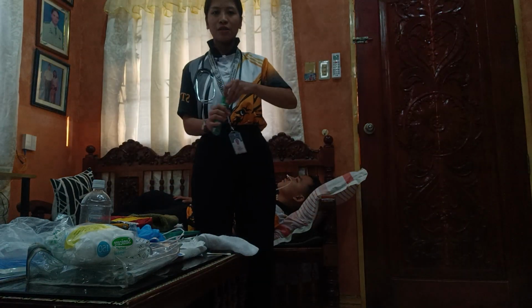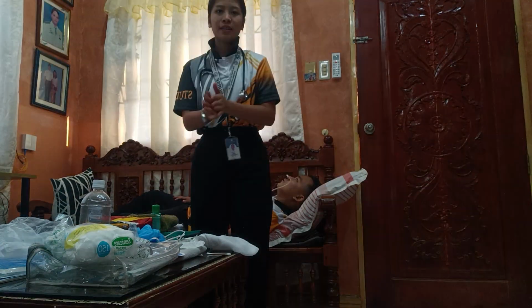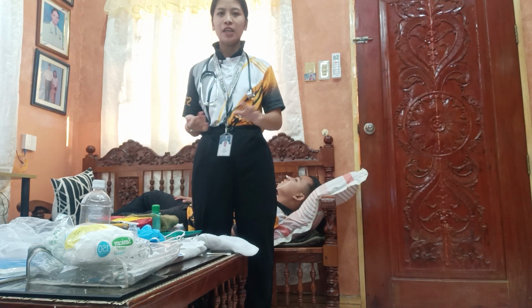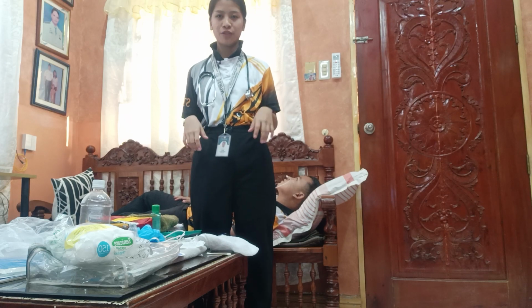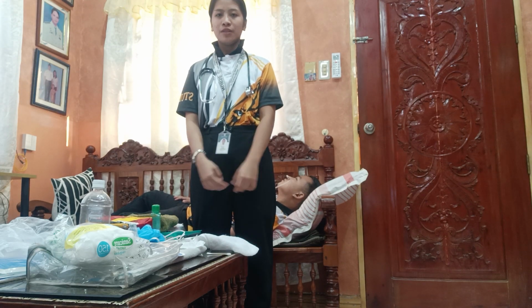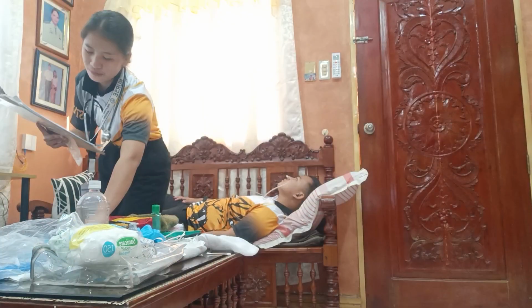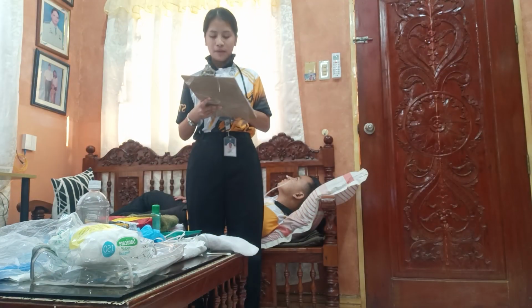So, with this alcohol, so removing the PPE properly reduces the risk of infection, transmission, and contamination of the other items, and hand hygiene prevents transmission of the organism. So, lastly is document the procedure. That's all, ma'am. Thank you.